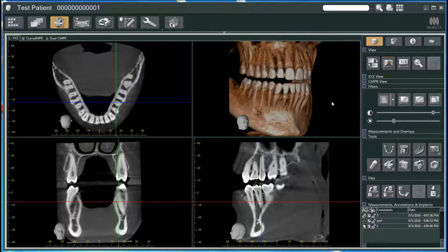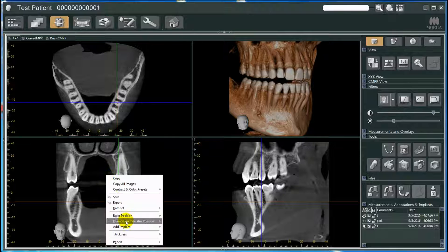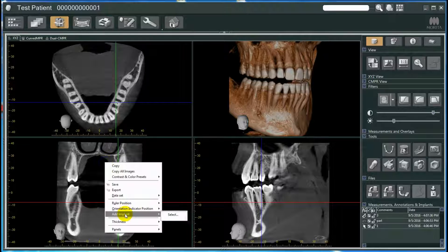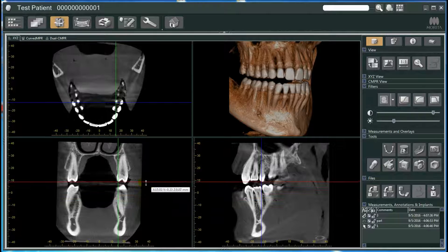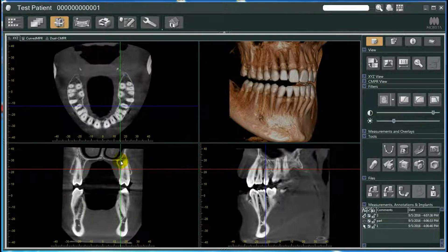We have our crosshairs set up that allow us to view and manipulate the image — you can turn these on or off. I'll start with them on and then turn them off when I want to look at something more closely without those lines over the image. You can also right-click to adjust contrast. I'll usually take off the little orientation heads in the corner that get in my way — they give you an idea of orientation and the head will move as you manipulate the image. From there you can view the image up and down, manipulating your sagittal and coronal slices very easily.